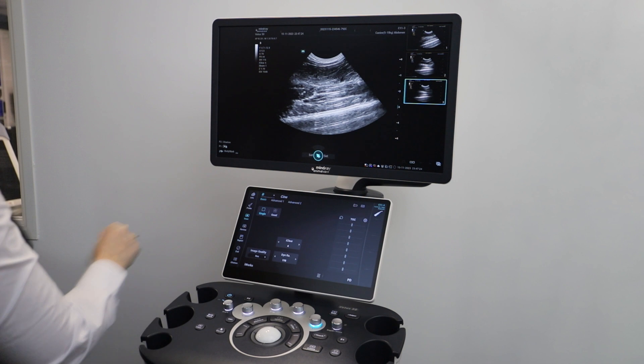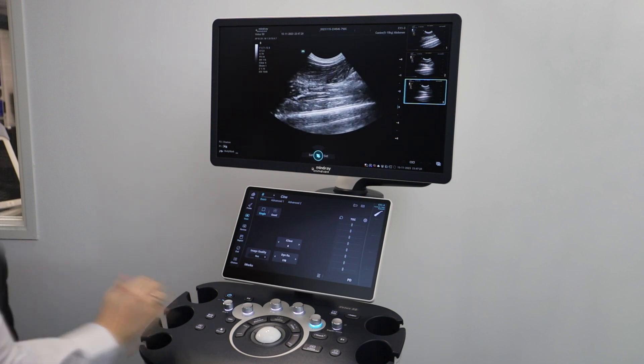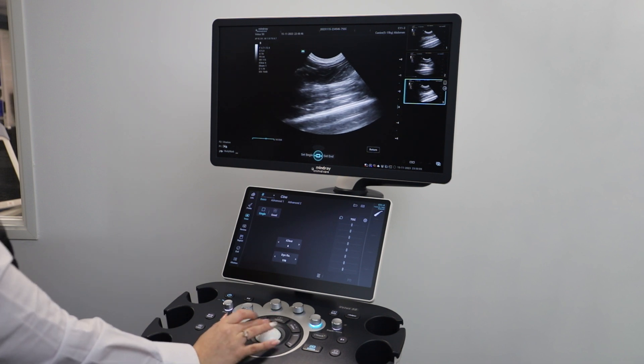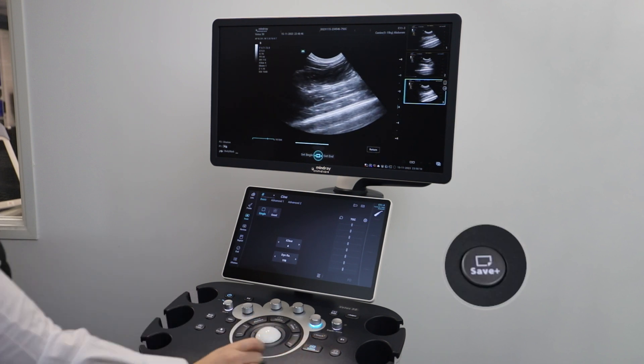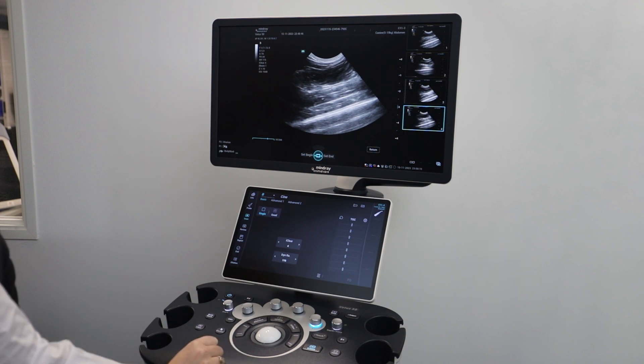do the same process as you would for reviewing an image, but double click on the tile and it will show you a playback. You can also save an image from the cine loop by using the trackball to move through each frame, then click save.